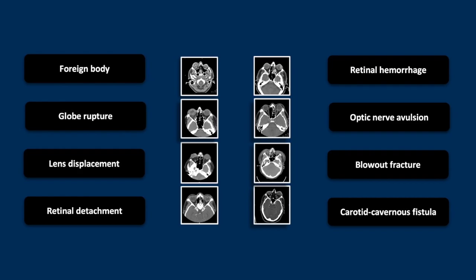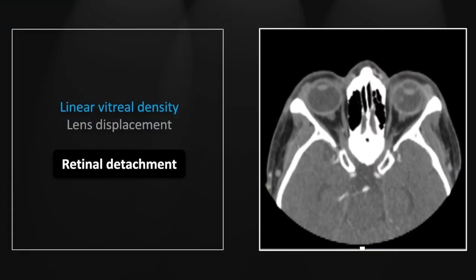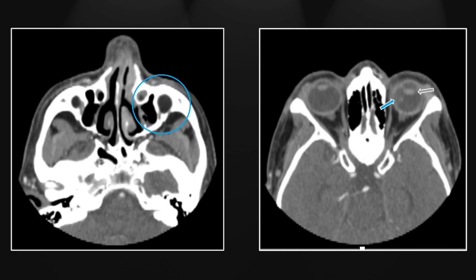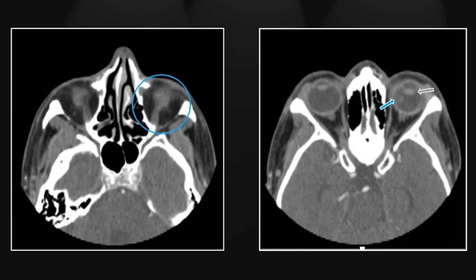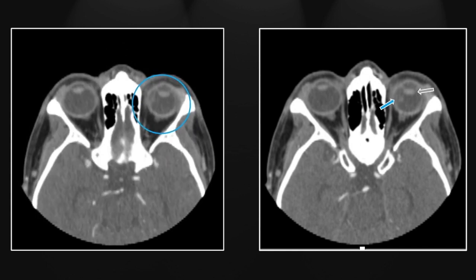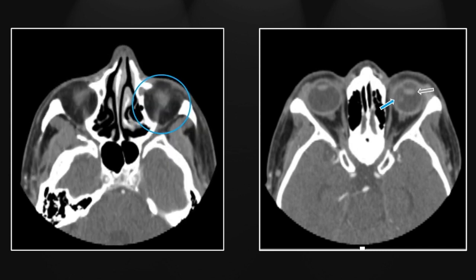Next is a case of retinal detachment. You can see there is a linear filling defect within the globe. Many of these retinal detachments begin peripherally, either far medially or laterally, so this is fairly typical. Note also the subluxation of the lens — slight posterior displacement without frank dislocation. On the movie you can see medially and laterally there are linear filling defects within the globe representing the detached retina.